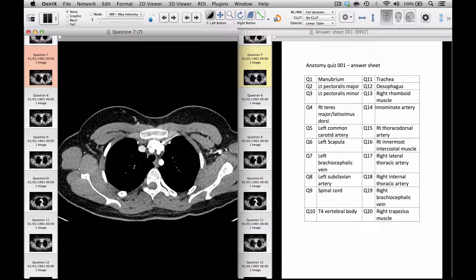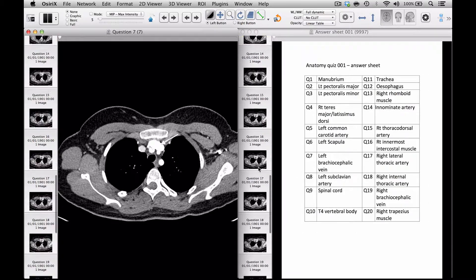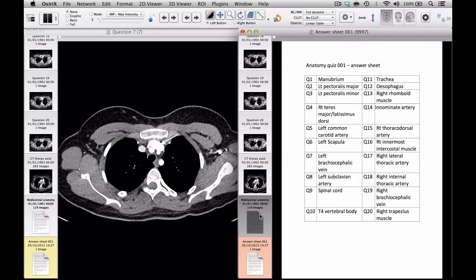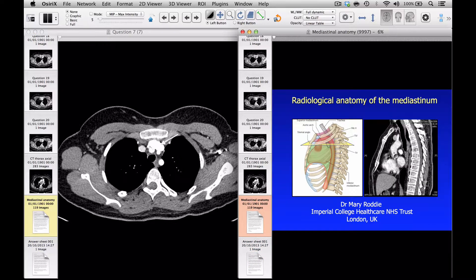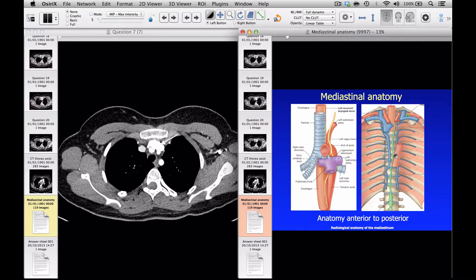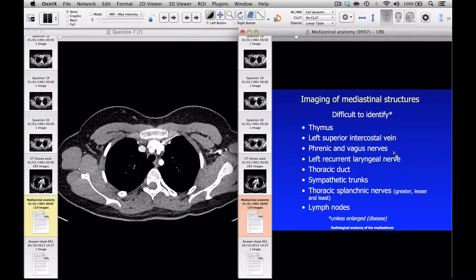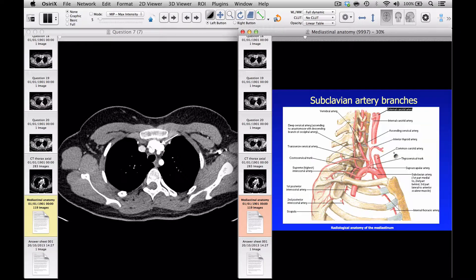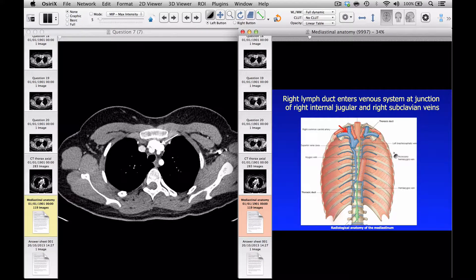The answer sheet will demonstrate what all the different arrows are. For example, question seven is the left brachiocephalic vein. Another advantage with OSIRIX is that, as well as adding in the answer sheet, a PDF of a PowerPoint presentation can also be added, which may contain a little bit more information about the anatomy being tested in that region — for example, a PowerPoint on mediastinal anatomy.